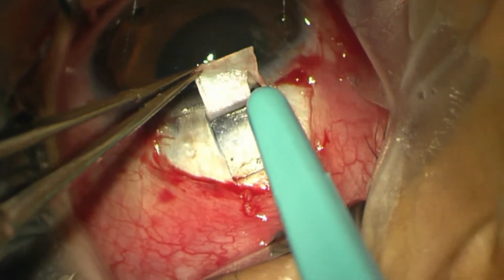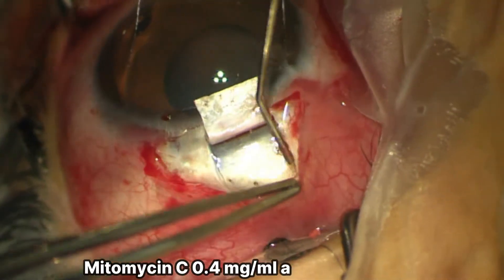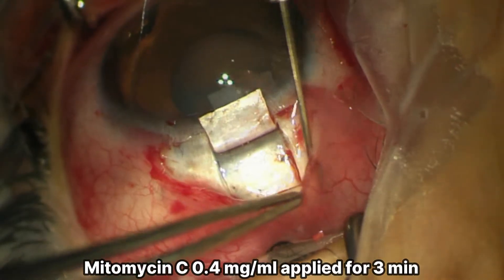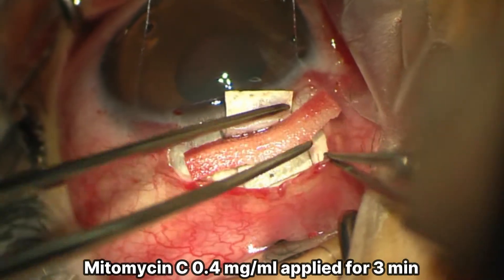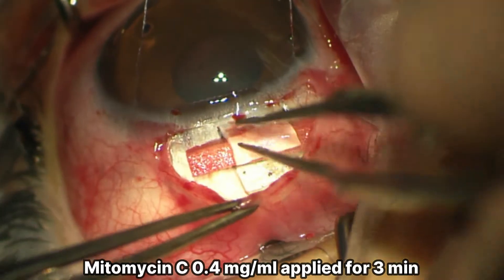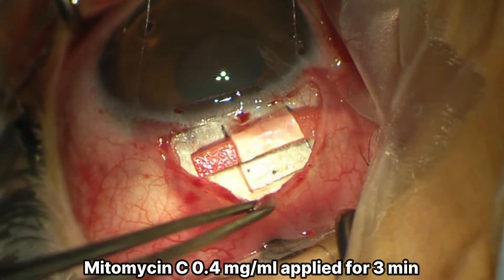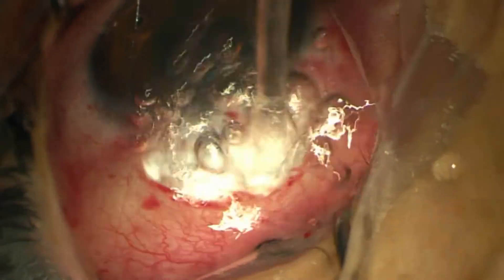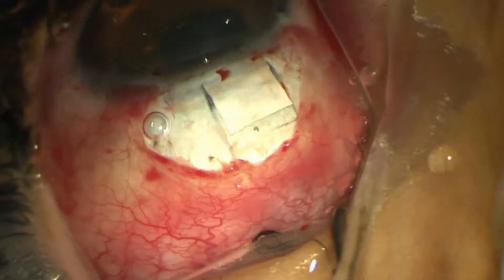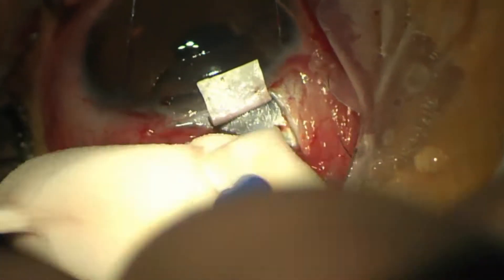Here we apply mitomycin C to the area. I like to use a syringe to inject the mitomycin directly, and it's also okay to place a piece of sponge into the bed of the flap to expose more of the area to the mitomycin solution.